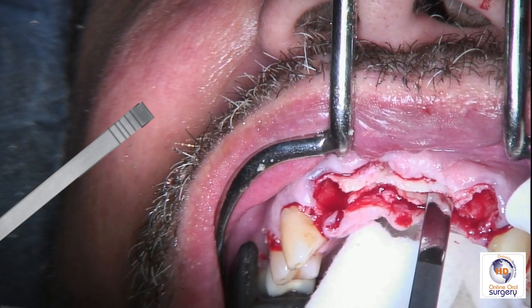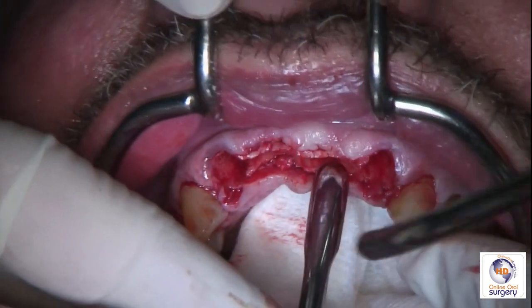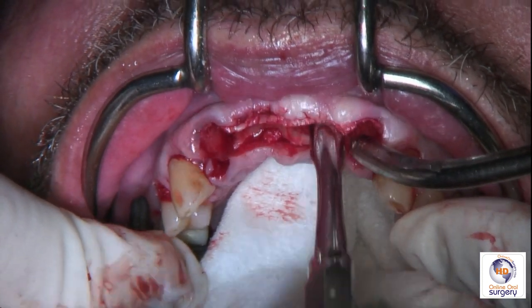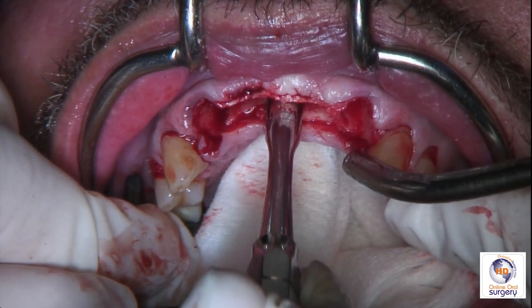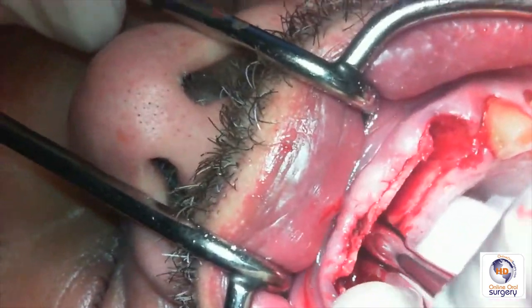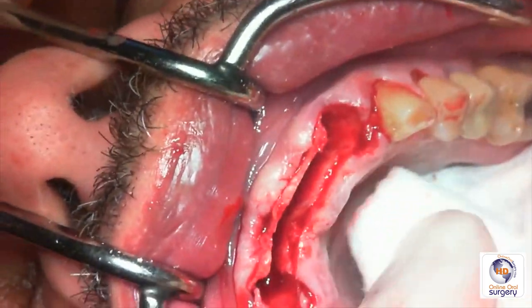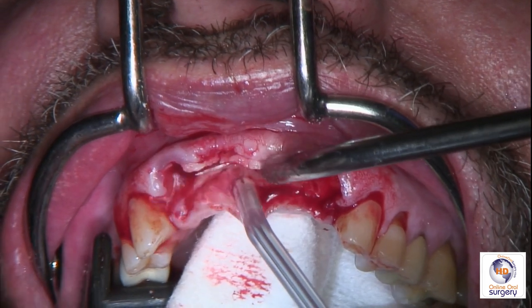And then to spread the ridge, we're going to use a spreading chisel, both a flat and a rounded chisel, and basically greenstick the buccal alveolar cortex and the palatal alveolar cortex out laterally. So as you can see, we're gaining approximately 3 to 4 millimeters of width of the alveolar ridge, mostly on the buccal, but a bit on the palatal also.